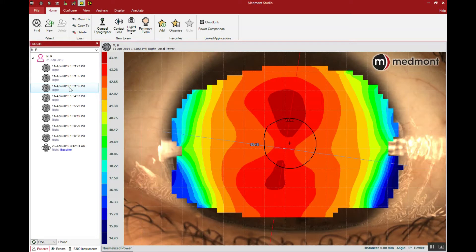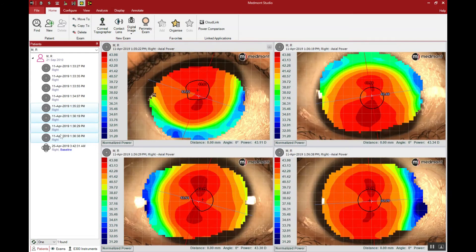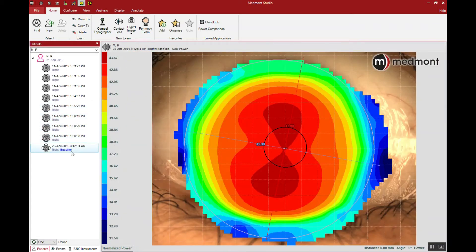Another significant advantage is the Medmont allows for composite topography. That's where we take multiple images in various directions — looking nasal, temporal, inferior, and superior — and merge them together with the central images. This allows us to push the ring reflection to the far periphery of the cornea and build a larger view of the eye shape. It's highly recommended that you do a composite topography on all of your pre-fitting orthokeratology cases.